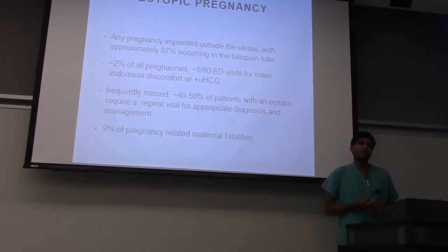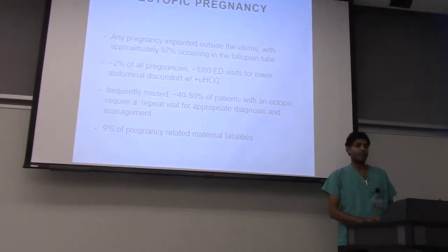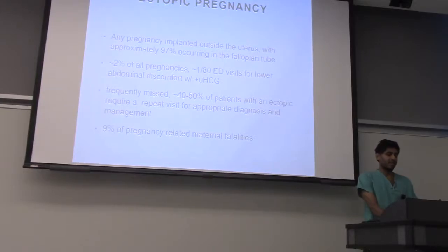definitely happens a lot. Ectopics, if they're obvious, are easy to identify, but they oftentimes have very subtle signs, and it's a very bad diagnosis to miss, because the outcomes are really bad. So if you keep those pitfalls in mind, and you advocate for your patient, and make sure that you do really thorough workups, you can minimize the chance of missing an ectopic or sending someone home to rupture.